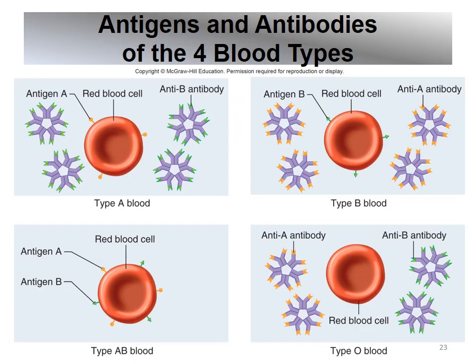So I'm back to this slide. So I want to look at how blood typing works. And actually, I kind of wish I was able to edit this, but I don't think I can. So we're going to look at two things on this ABO system. One of them is called recipient, and the other one is called donors.